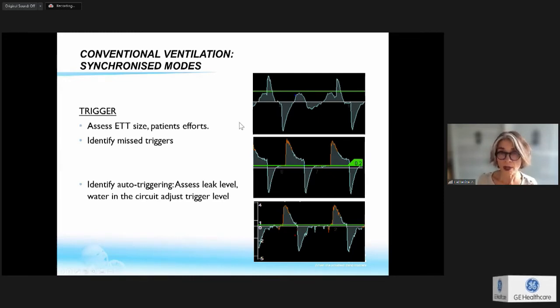But you might have some problems. Like here, what happens? I see that my patient took a breath, the inspiration, the exhalation here, but you see the effort that the patient did was too small for the ventilator to reach the flow trigger. So the ventilator doesn't pick up the breath of the patient. So here, even if you are in PTV, the ventilator can't pick up the breath, so you will have some asynchrony. So what I have to do is always to make my trigger sensitive enough, to drop it, to make it sensitive enough to pick up the breath of my patient. At the same time, I have to be careful that it doesn't pick up some artifacts.